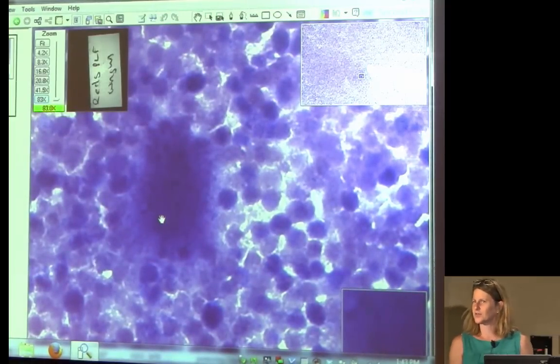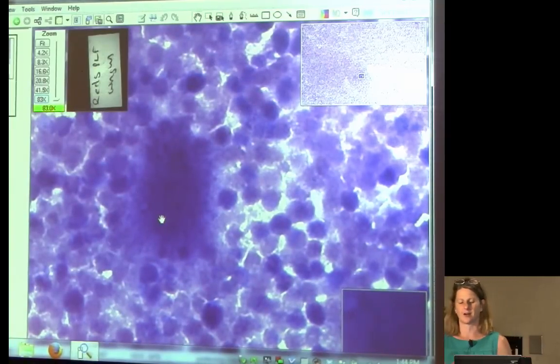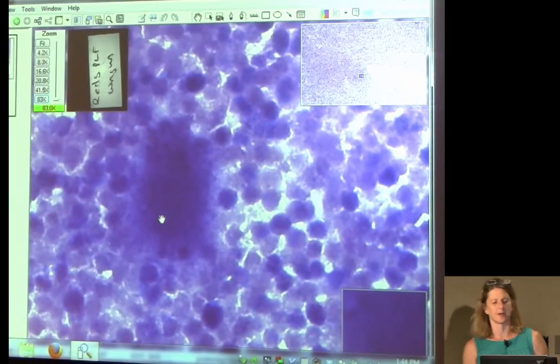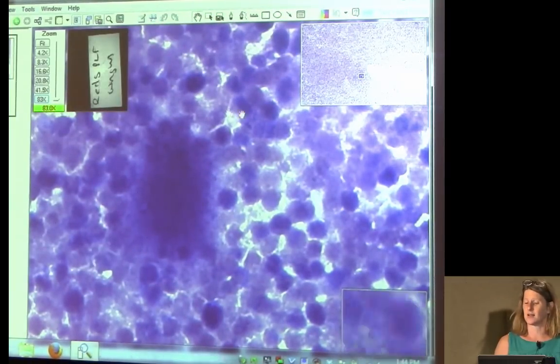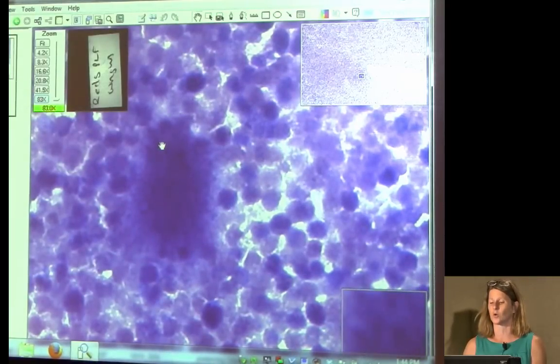Now, do you always see the neutrophils like this? No, we don't. But whenever I see neutrophils and macrophages in a mixture, like a foreign body type response, I look for these bugs. And in cat pleural effusions, I'm always looking for these bugs. So this is just like pus and dead dying neutrophils, and here is our cause.